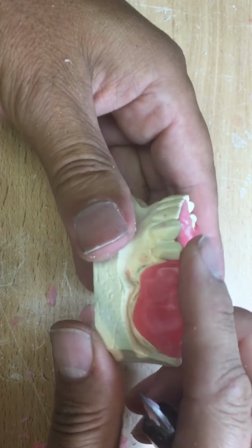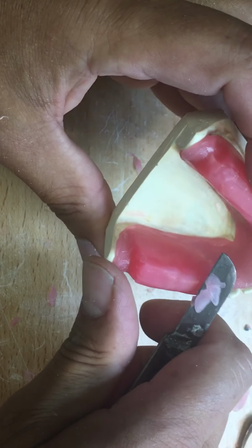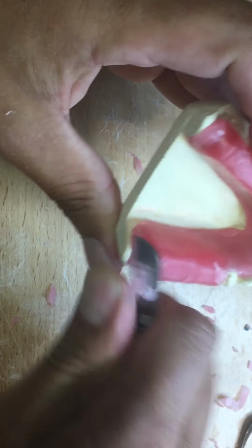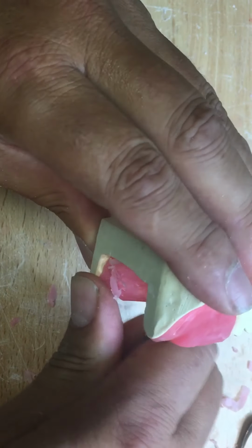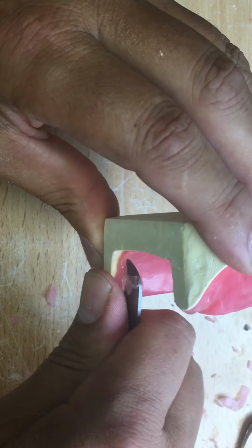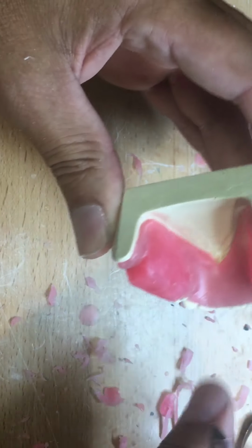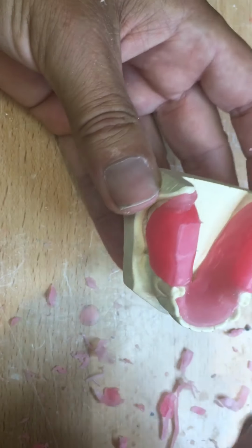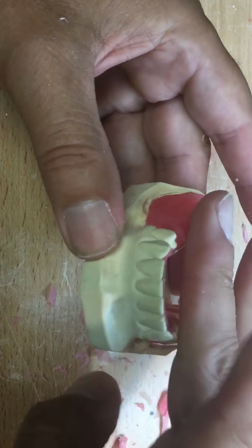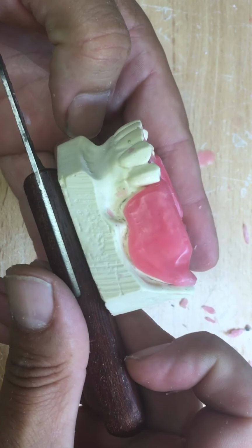This is a guesstimation of the height of occlusion. I'm just a little bit above. I don't know if there's overextension in the back, but if it's a full denture, I've given the dentist time and room to parallel this occlusion rim up with the opposing dentition in centric relation or occlusion. Centric relation for the full denture.